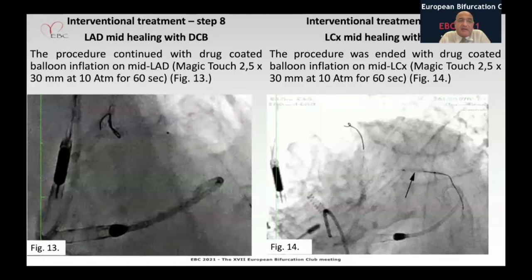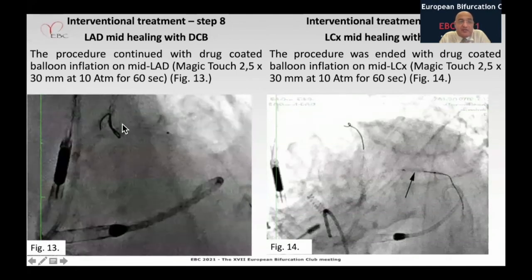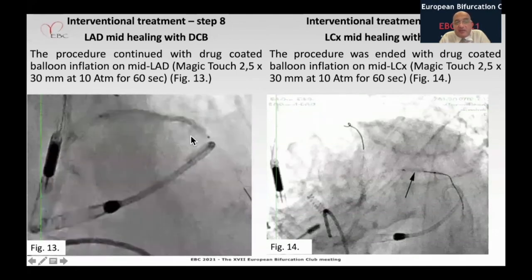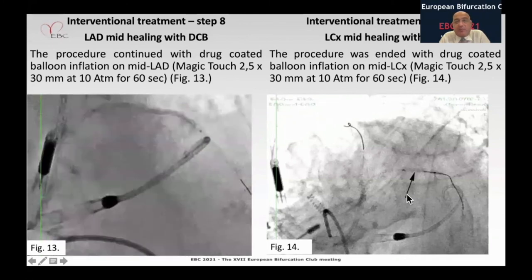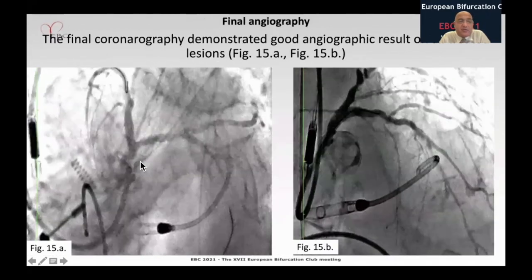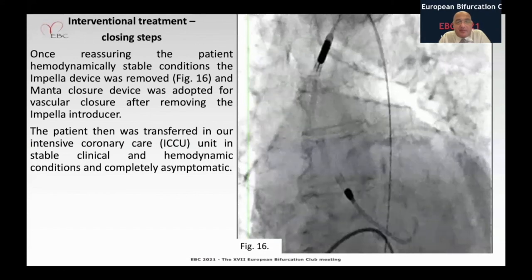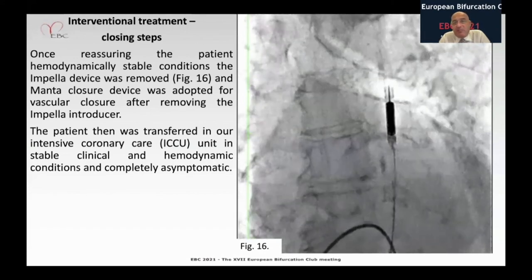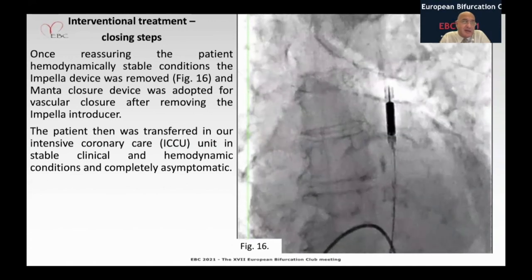After that, to reduce the metal, without using stents, we used the drug eluting balloon for the proximal and mid left descending artery. The same thing we performed for the circumflex artery, with the final result, which is quite acceptable. Finishing the procedure, we removed the Impella device and closed the access site with a MANTA closure device.